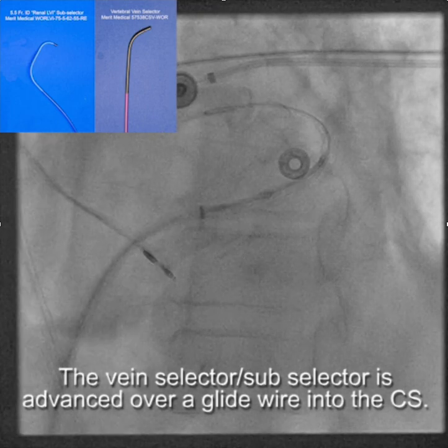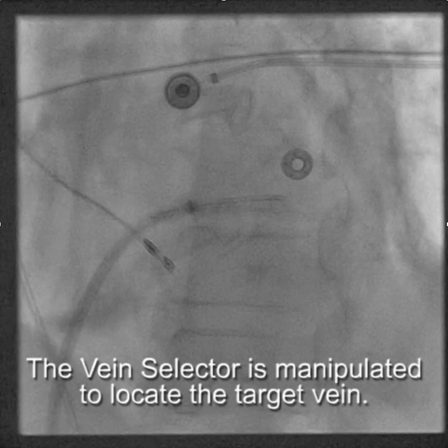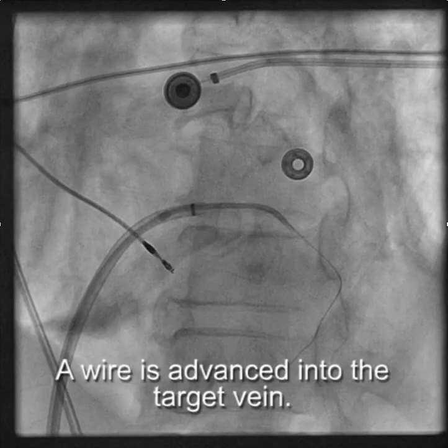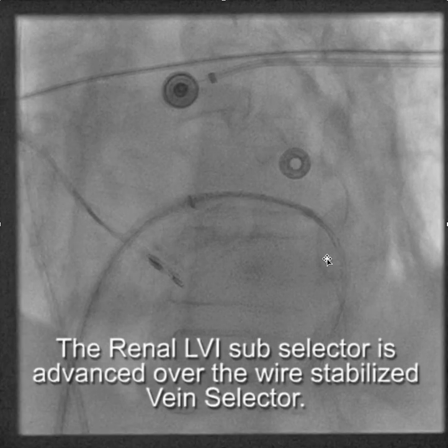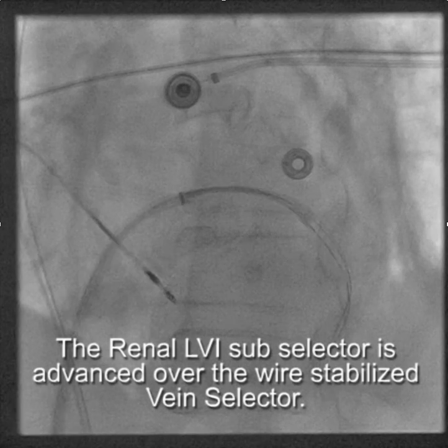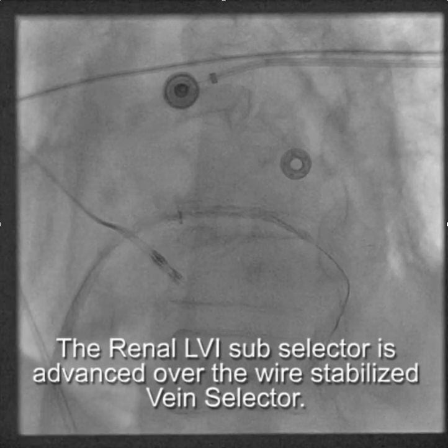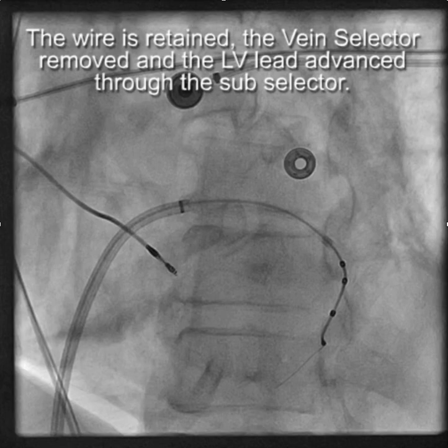We take the glide wire out, then use the vein selector to locate a target branch with little puffs of contrast and catheter manipulation — there's the target vein. We advance the wire into the target vein, then advance the vertebral-shaped vein selector over the wire, and use that combination of the wire-stabilized vein selector to get the subselector deep into the branch. We remove the vein selector, retaining one of the wires, and advance the lead nice and deep into that target branch.